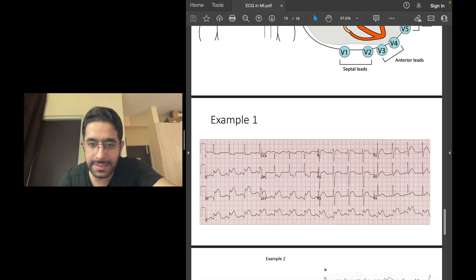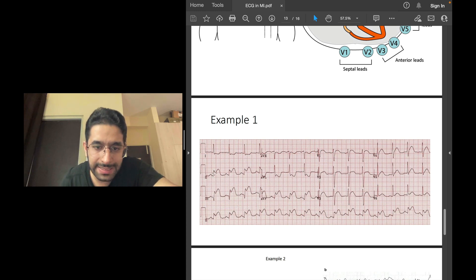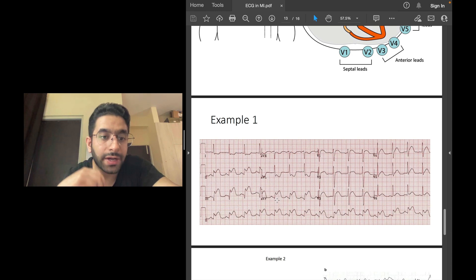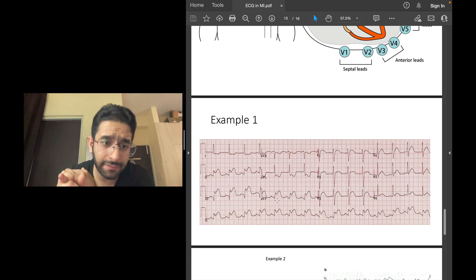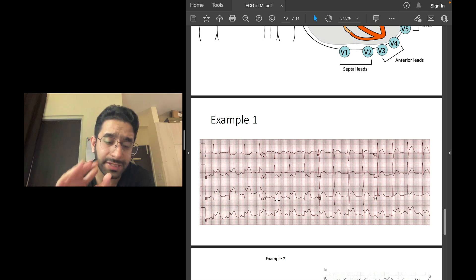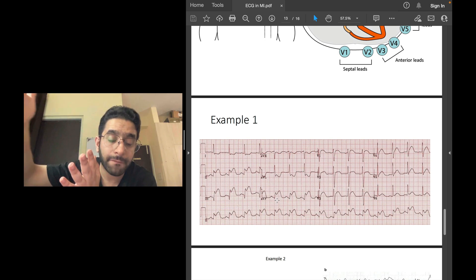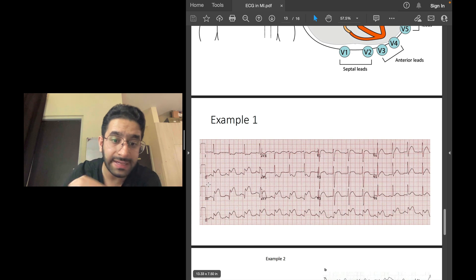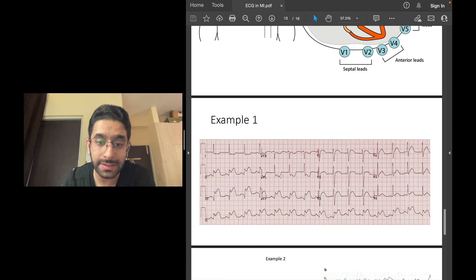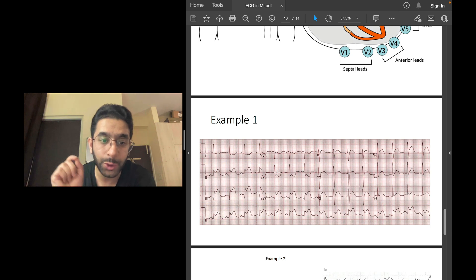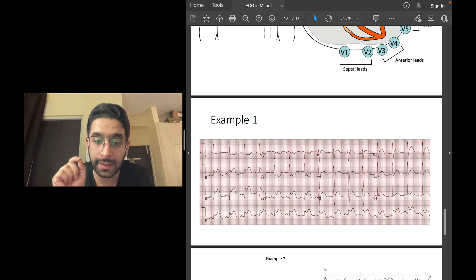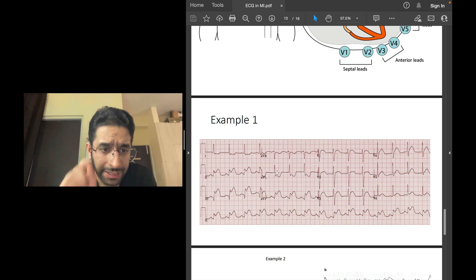Now let's look at ECG examples. In this ECG you see ST elevations in leads 2, 3, and AVF. Notice the reciprocal changes: since leads 2, 3, and AVF look at the inferior surface and show ST elevation, the contralateral leads — 1 and AVL — show the mirror image, which is ST depression. This ECG shows ST elevation in leads 2, 3, and AVF with ST depression in leads 1 and AVL: inferior wall myocardial infarction.